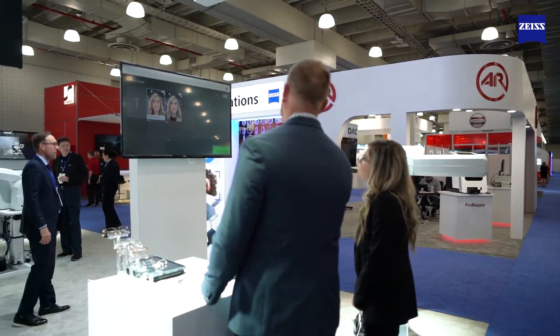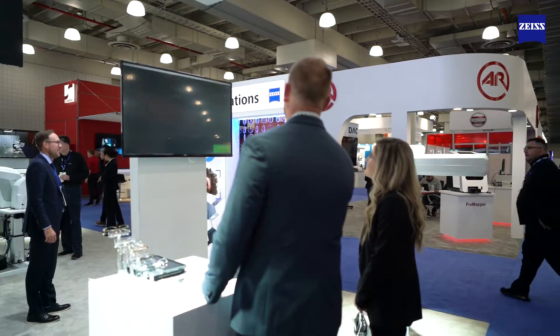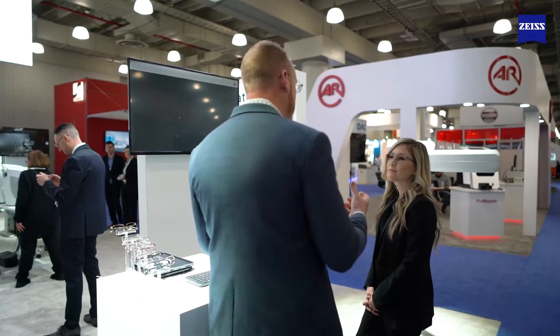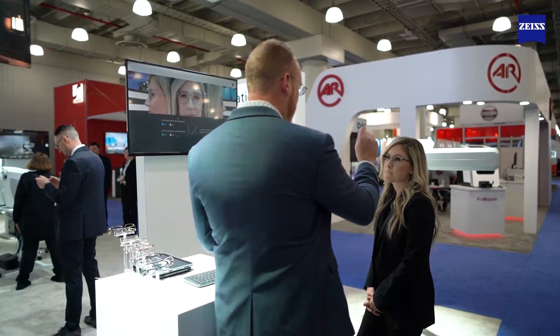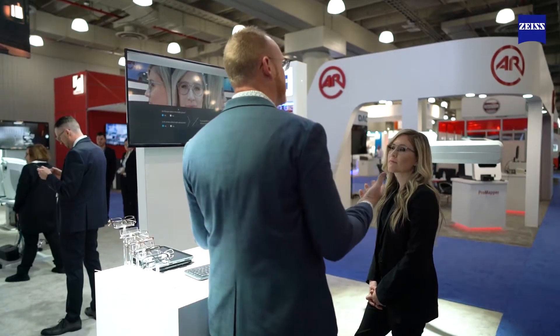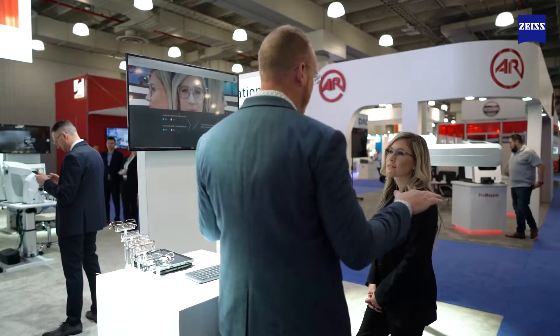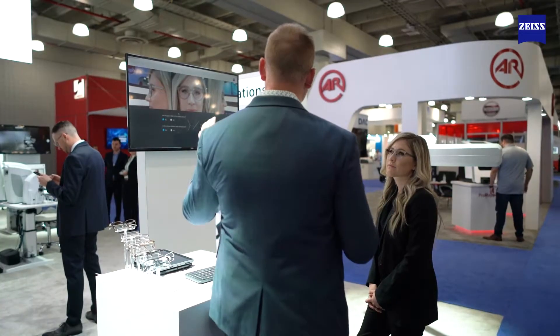Now you can choose between both of these frames and you can see how each one looks on you as I rotate the pictures 180 degrees. Previously what we had is you would dot the lens and then you would measure it with a ruler, but that was completely subjective.